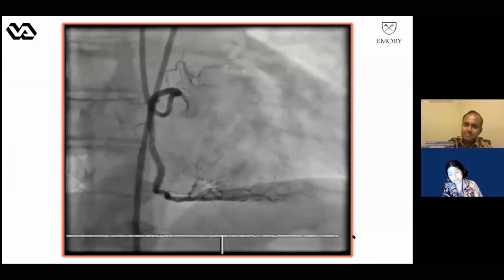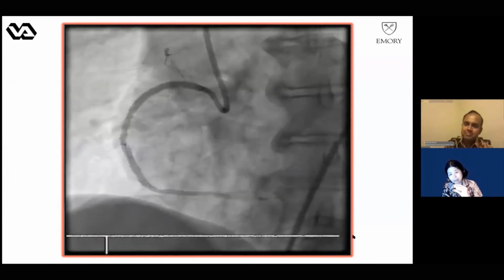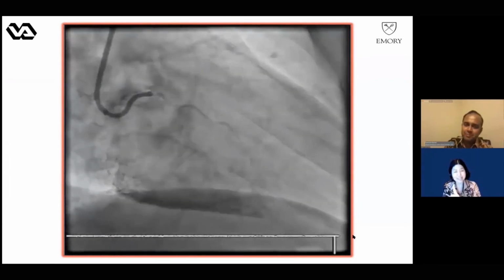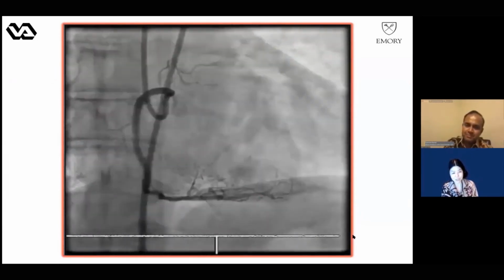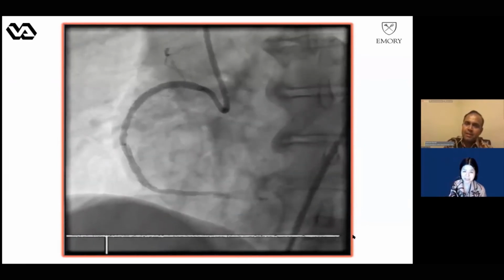Actually, the entry side is already behind the stent. Yes. So because of the pushing into the lumen, you have to put the stent. But there is one slice where I still see hematoma, which may not be covered by the stent, but that should be okay, because you covered the entry site already, and the lumen is big enough.